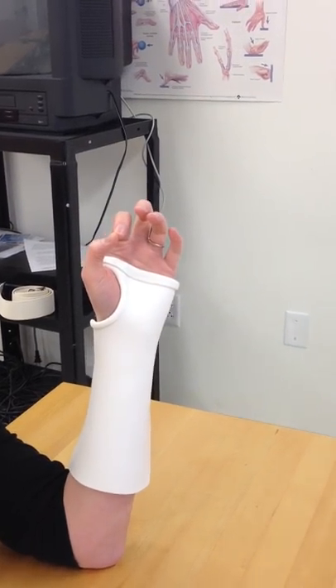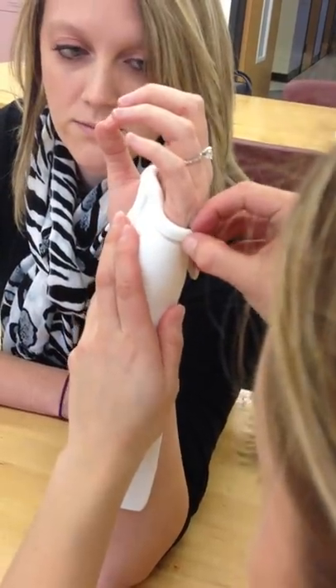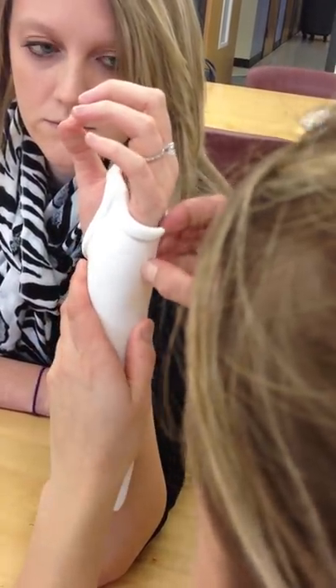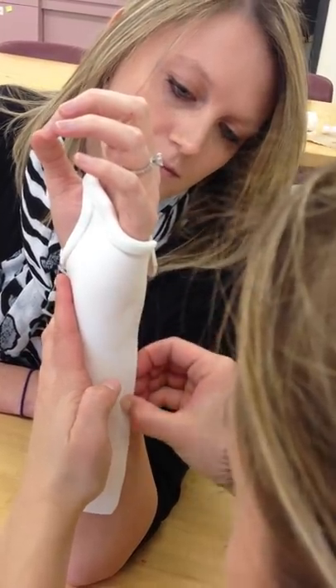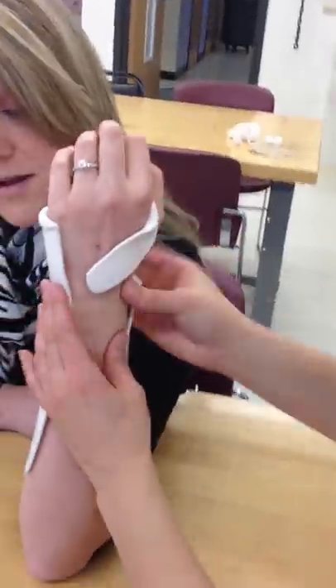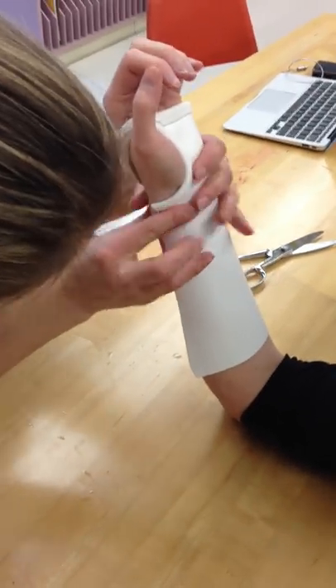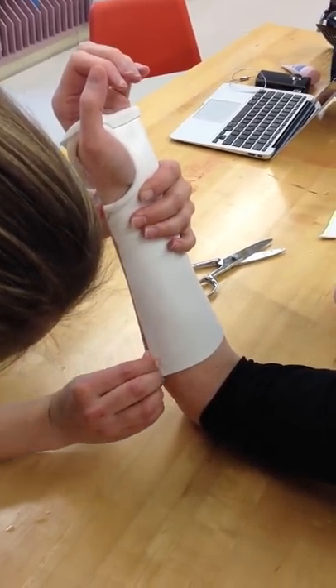You can use your thumbnail — that's what I usually use so I don't have the yellow again. I'm going to trim this down a little bit — about half that width there. Not overlapping, because otherwise you're going to get pressure. Here we go. It's good up here, but it gets a little wide, so I'll just trim a little bit of that off.